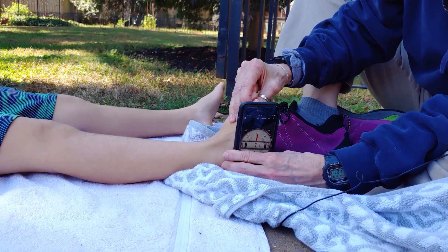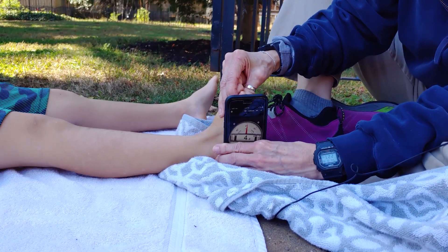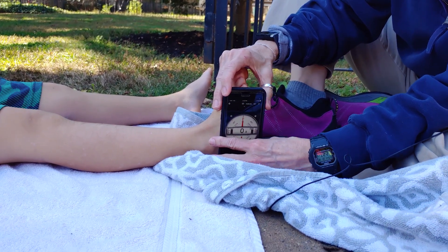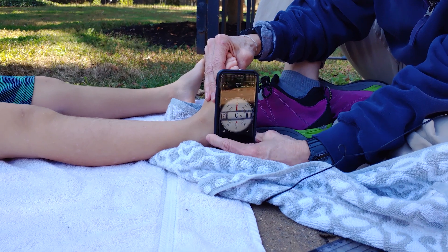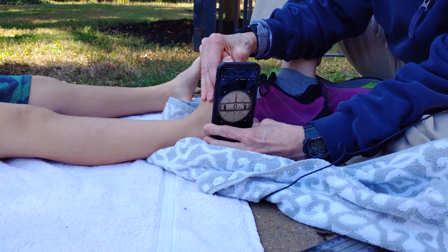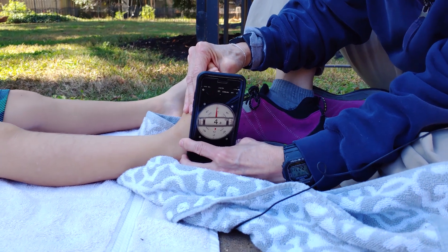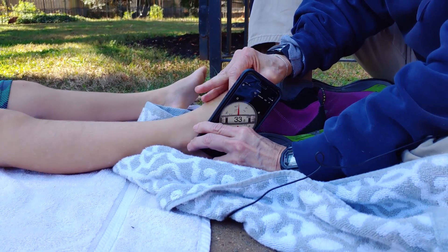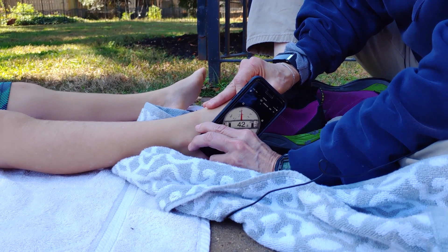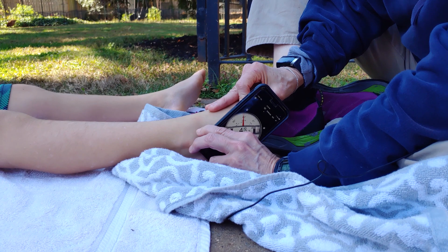By keeping it flush against his leg, I can see how far that can go. Similarly, I can see how far he goes down in plantarflexion. I've got it centered on his leg, straight up and down, and I can go down to see how far he can get into plantarflexion. It looks like he can get down to 46 degrees.